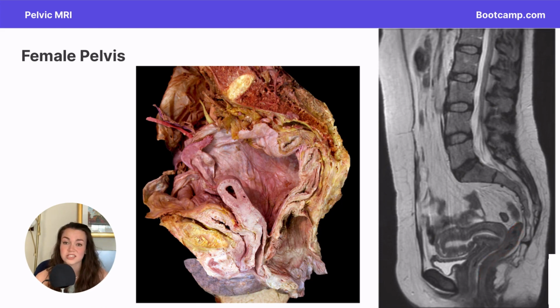However, your next structure anteriorly is going to be that birth canal. So you've got the vagina and then the uterus coming up. And on our patient here in real life, it's flopped down a little more than it is in this cadaver specimen. But you can still follow the birth canal up through the vagina. Here's the cervix, and then over, around, here's the uterus, and then down. Then right here is your bladder, and again, glowing the brightest white. That's going to be a great landmark for you. And then your pubic symphysis over here, and tail of the spine over here.